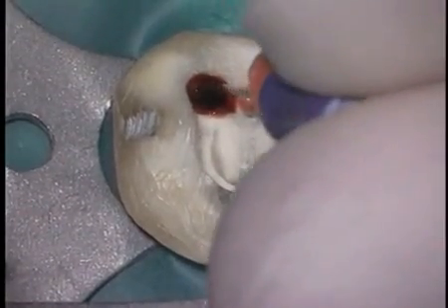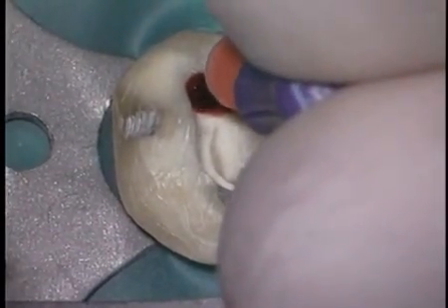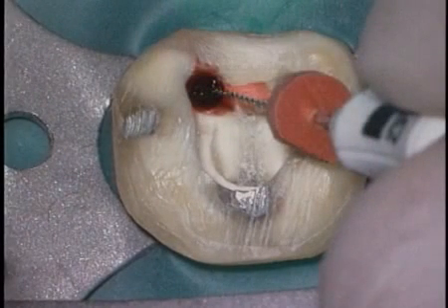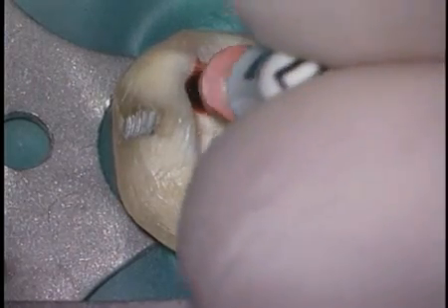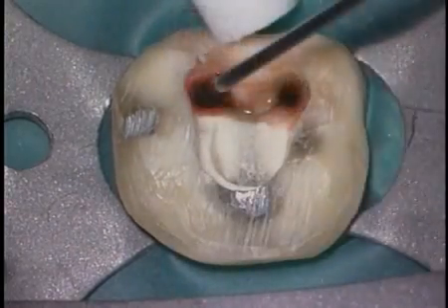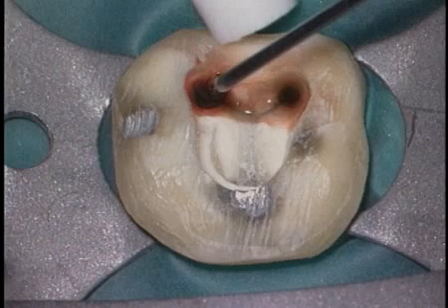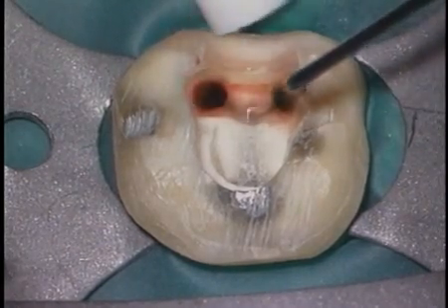Oftentimes, when placing files down the canal, they'll inadvertently pass out through the perf defect, creating spontaneous bleeding that again obstructs vision. The trick is to place small instruments into the apical 1/3 of the root, create a glide path, and shape the canals, recognizing these canals are not perfectly isolated from the lateral fluids. Fortuitously, by shaping the canals now, we're less likely to disturb the subsequent restorative material.